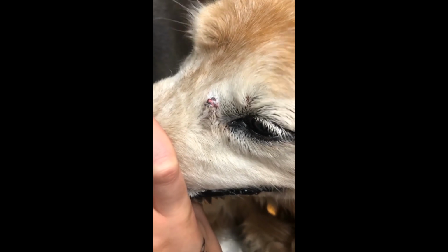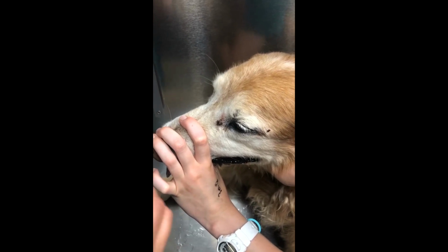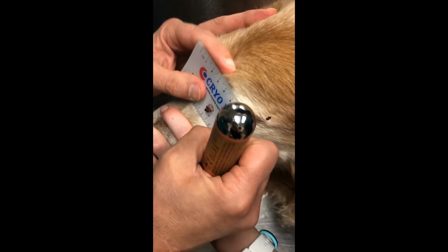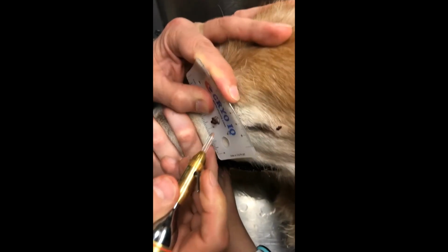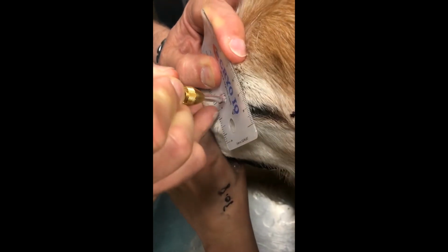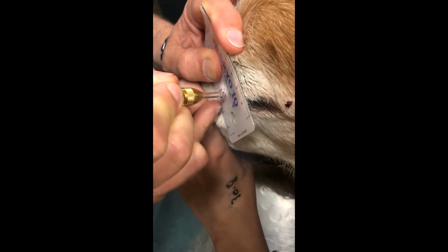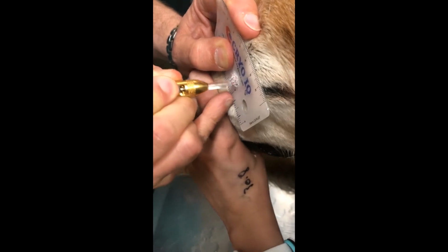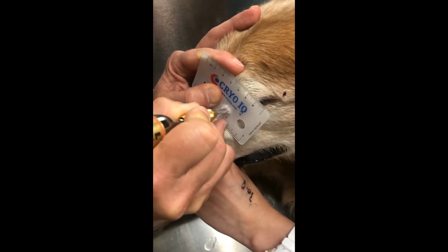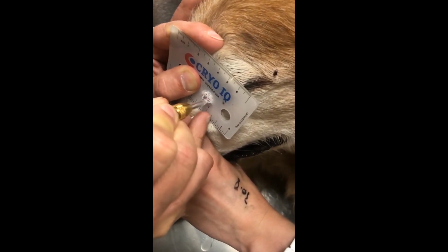We will repeat the freeze shortly. So now that the lesion has thawed, we're going to go ahead and do a repeat freeze cycle. Again, I'm using the plastic measuring device just to prevent the surrounding tissue from freezing. Knocking off any ice crystals as we go, covering the entire lesion, and freezing as quickly as possible so as to cause destruction of the cellular membrane.